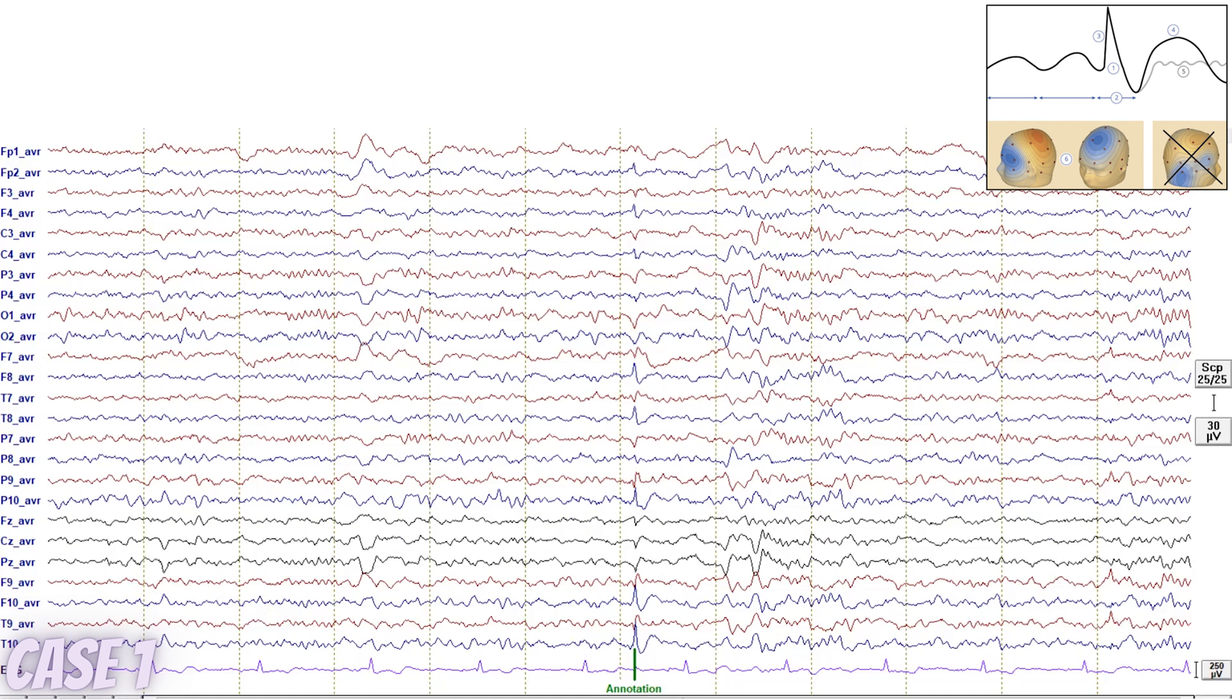Two, three. I think it's asymmetric, but I'm not sure, so maybe three. Look how the downgoing is deeper than the upgoing. Yeah, right, okay. There is a nice aftergoing slow wave, especially I have T10 down there. I know that it goes hand in hand with the spiky thing - spike down and a slow wave in all the channels here.